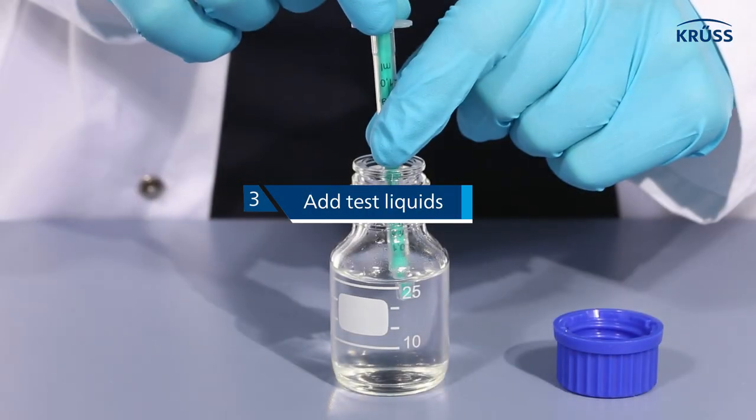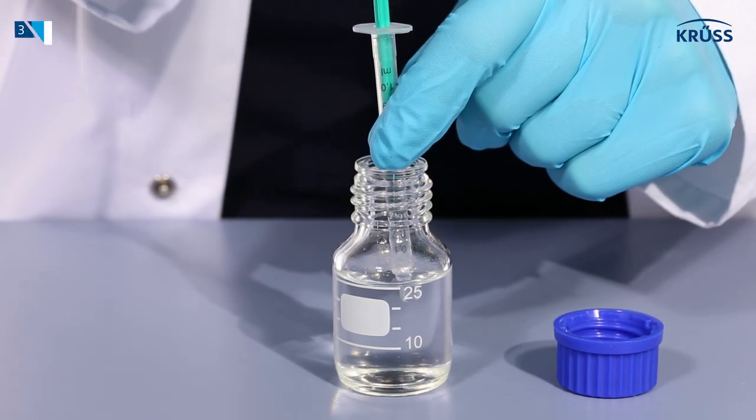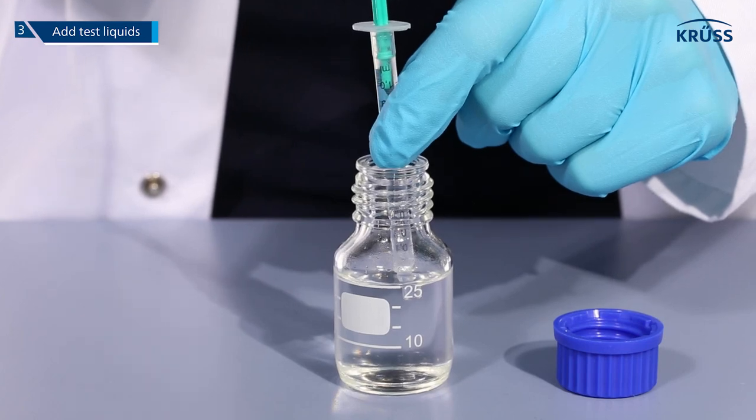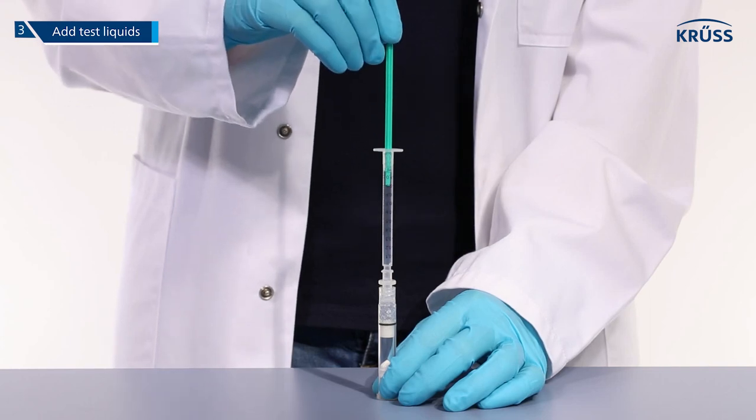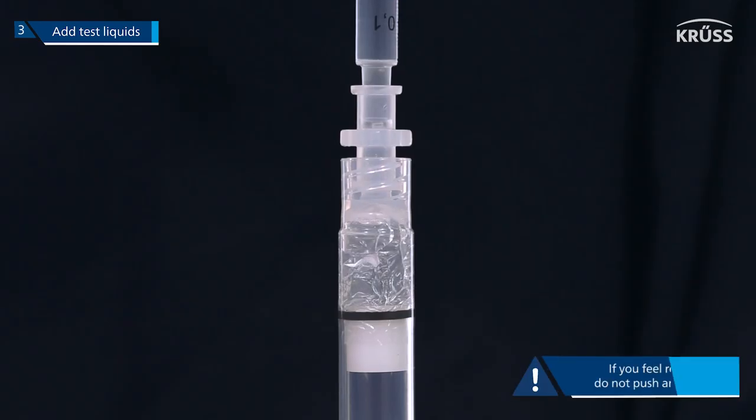Step 3. Pull approximately one milliliter of test liquid into an empty syringe. Attach the syringe to the luer adapter and gently push the liquid into the cartridge.